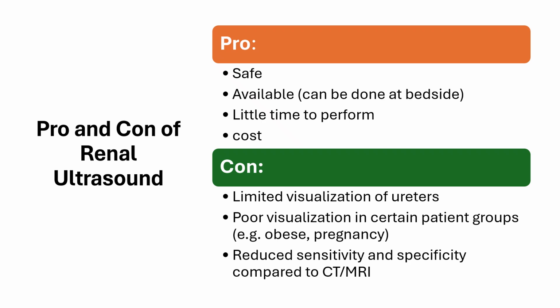The downsides or shortcomings include limited visualization of ureters, poor performance in certain patient groups, such as obese patients and pregnant patients, and overall reduced sensitivity and specificity compared to CAT scan or computed tomography and magnetic resonance imaging, or MRI.